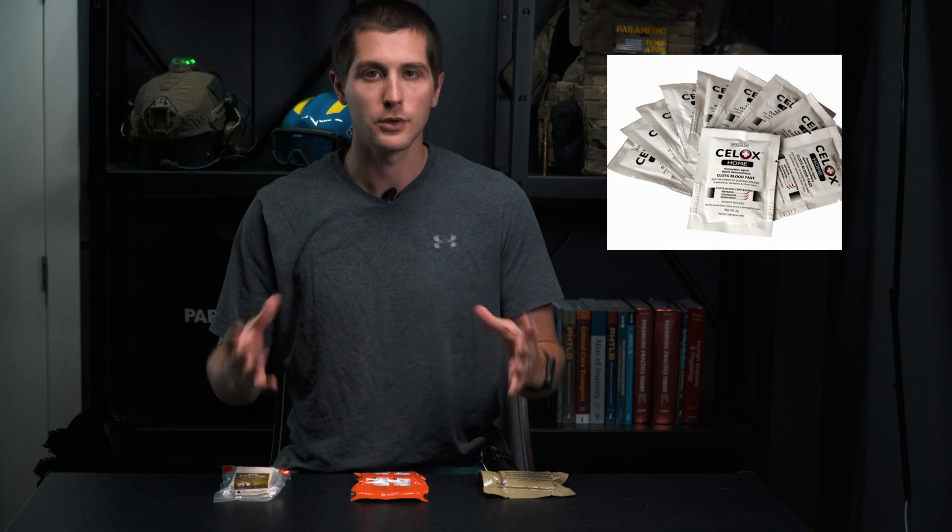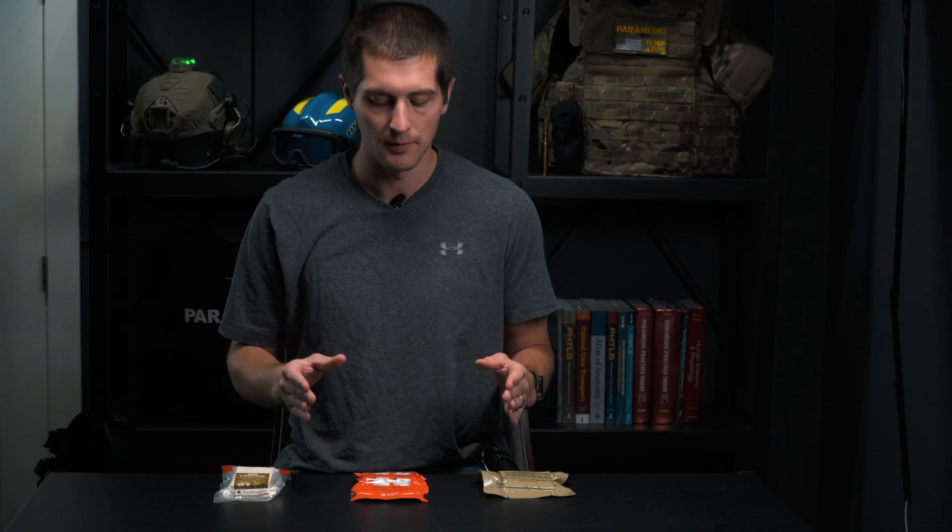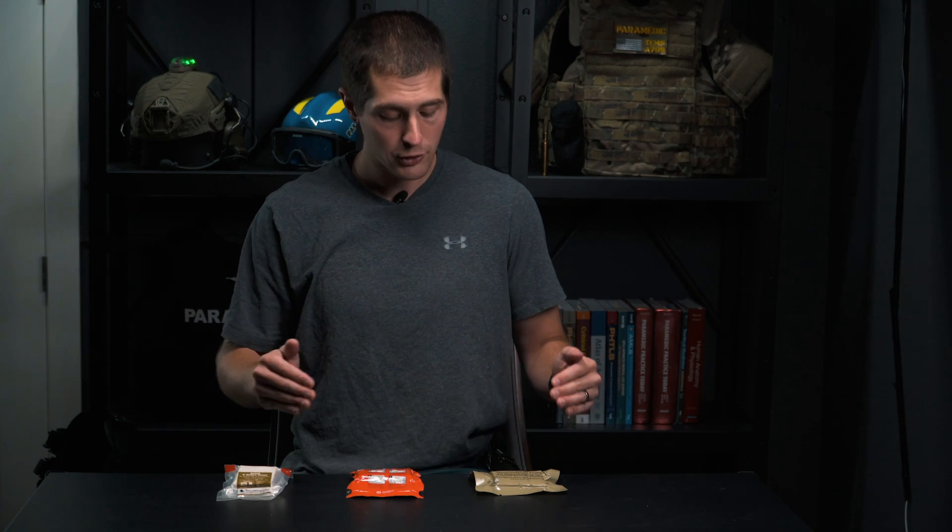There are some other items on the market — the most common one I see asked about in the comments is the granular powders. While they did use those in the military and they were approved for a short period of time, early generation powders caused an exothermic reaction that would actually burn patients when placed in the wound. They fixed that issue, but soldiers in the field found that on really deep and narrow lacerations with arterial bleeding, it was hard to get the powder all the way down to the wound site. And on windy days, the powder would blow out of the wound before they could even apply it — which is why we've moved to impregnated gauze with the material right on it.